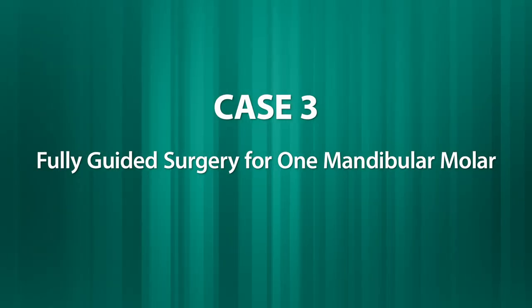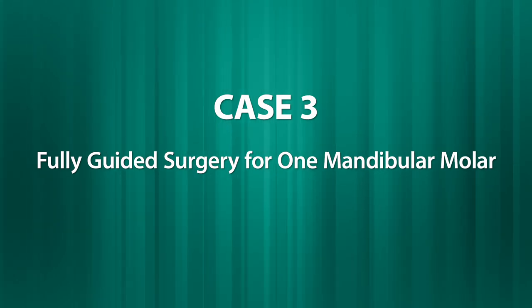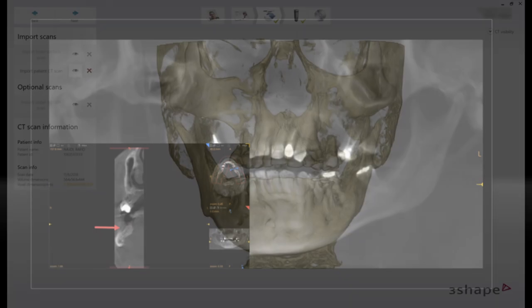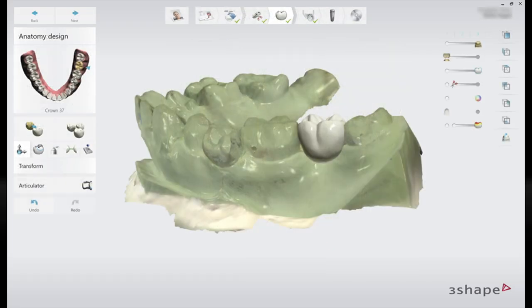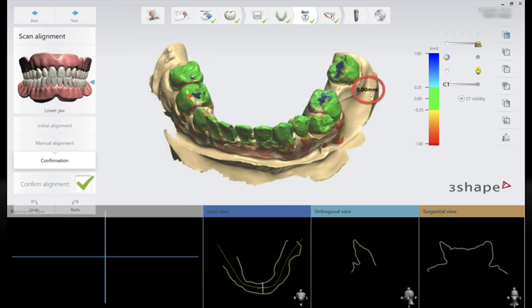In the next case, case number 3, we are going to demonstrate a fully guided surgical protocol in placing 4.5 by 6 implants. So this is the patient's pre-operative CBCT showing missing tooth 3-7 with a horizontal bone deficiency at the buccal site. The same protocol: importing the patient's CBCT, the STL with a digital wax-up, then surface registration of the CBCT and the STL, and here zero indicates no deviation between both surfaces.